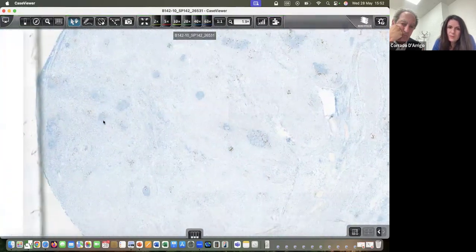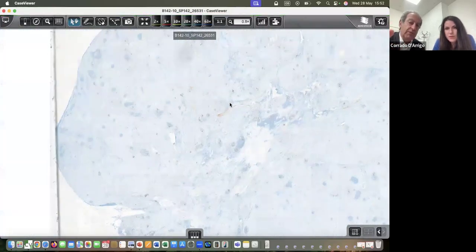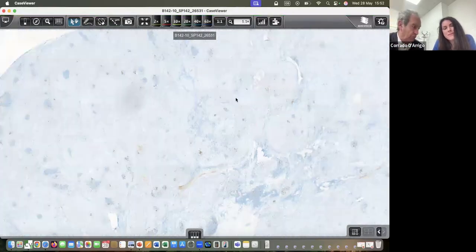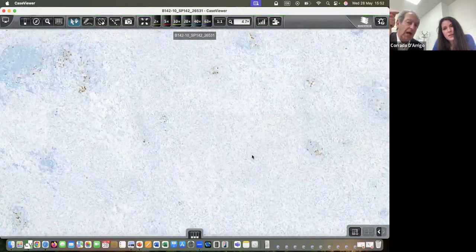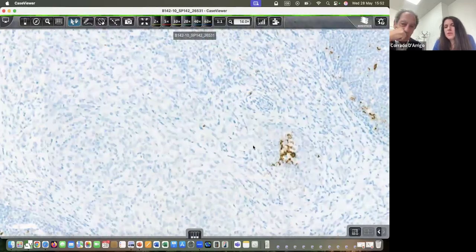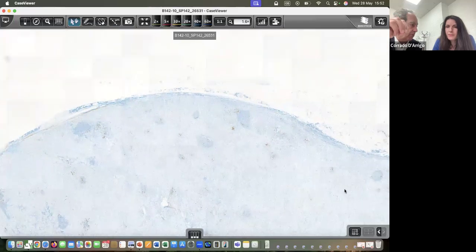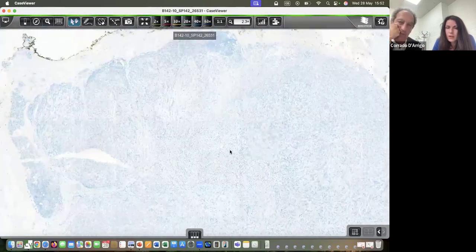So they're immune cell staining. But even so, they're so surrounded by tumor that some people would take the view that the whole lymph node is no longer a lymph node, so this is just tumor tissue, and they would report everything. Some other people say, I only report immune cells that are touching tumor cells, or within some sort of desmoplastic stroma developed. Yes, but inside the lymph node, I will only report immune cells in continuity with the tumor cells.